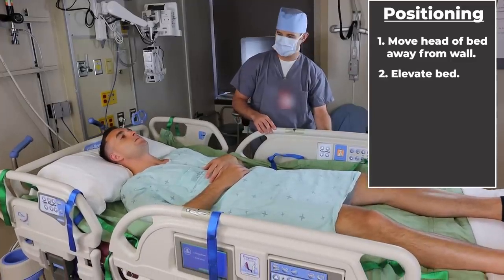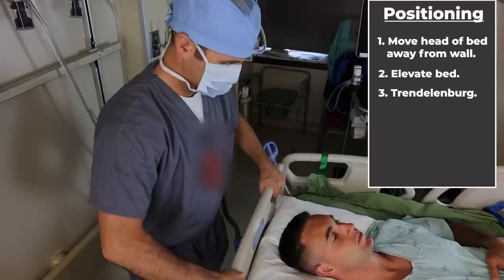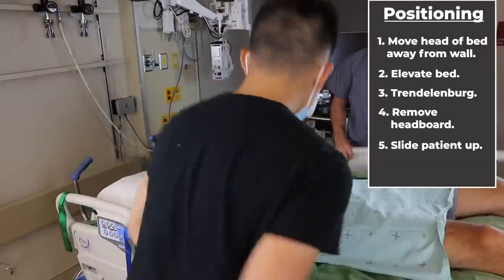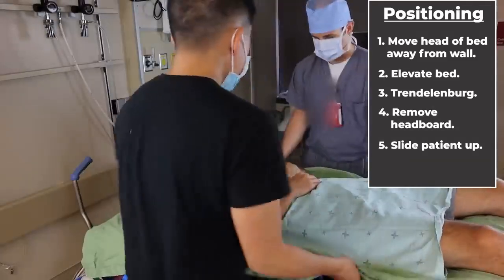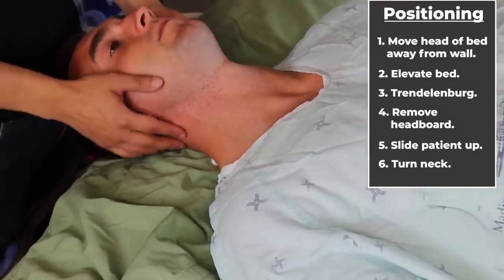And then he places the patient in a little bit of Trendelenburg, which helps to engorge the veins of the neck. He takes the headboard off the head of the bed, and then we slide the patient as far up as he'll go in the bed. Finally, gently tilt the patient's neck off to the side.